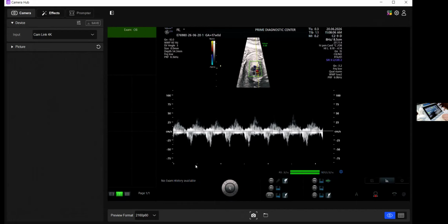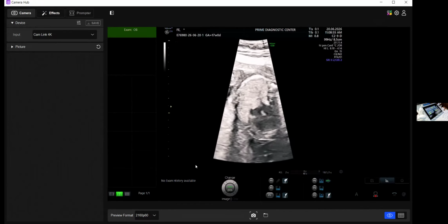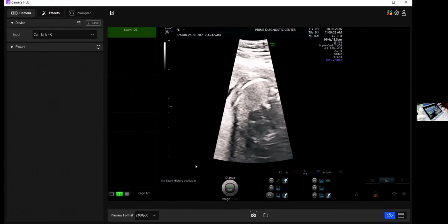And you actually reduce the gain to calculate the various measurements. I'm not going to do it again. And let me ask a specific question, hunt for the appendages. That's what somebody wanted to know.